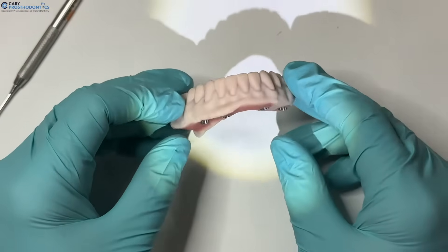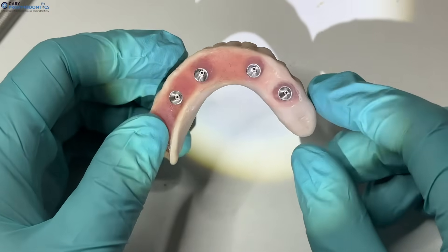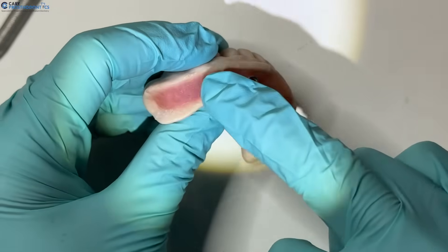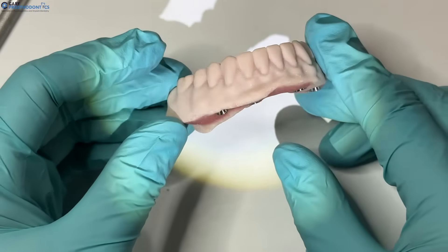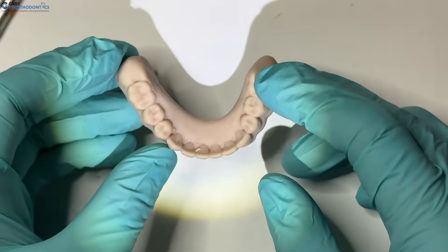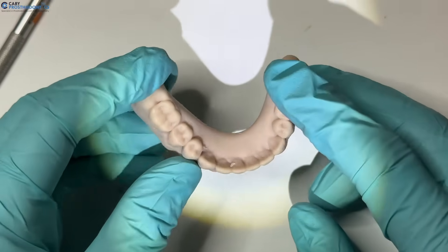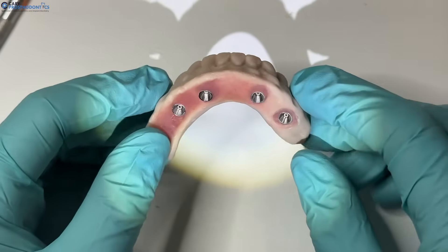Here we have a model where one side has been picked up and contoured, and the other side has a pickup done with acrylic added but not yet contoured. We're going to go through the steps of contouring. Also note that for this model there are no holes made for the smart denture, so we can go ahead and do that.